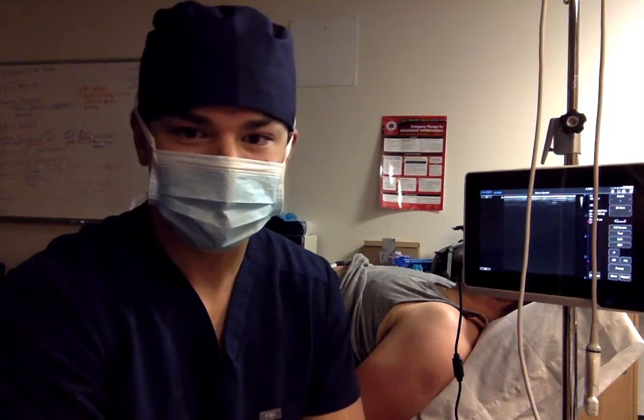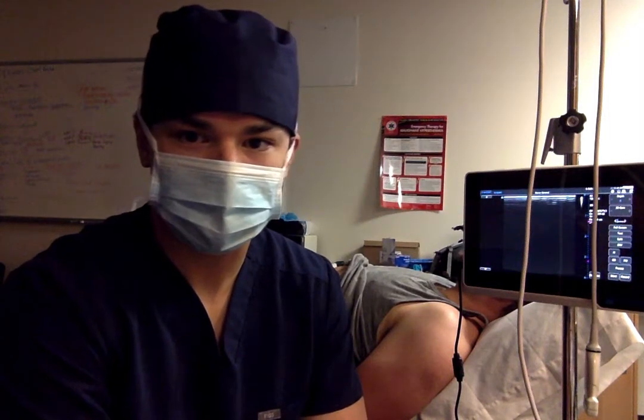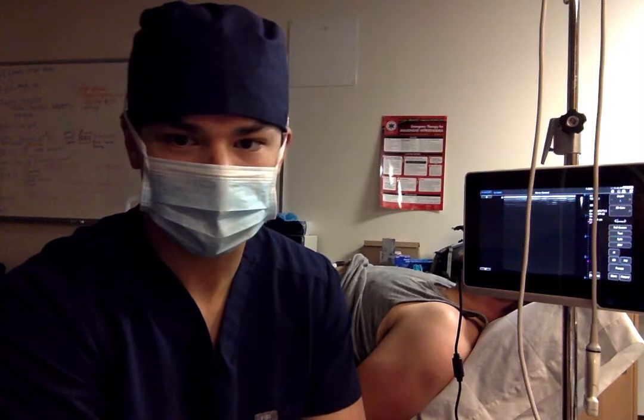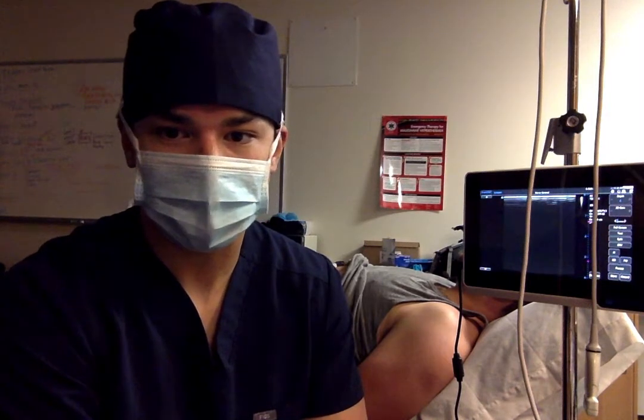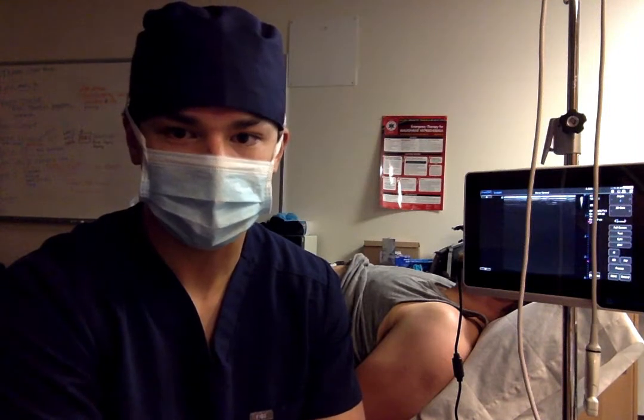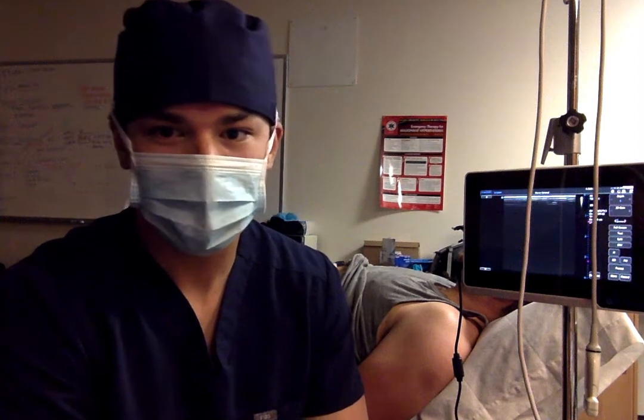I'm going to be doing a subcostal TAP block today, so I'm going to review my patient's chart before going into the room. I'm going to be looking at any abnormal health history, height, weight, allergies, coagulation, platelets greater than 100,000. Go into my room, introduce myself.